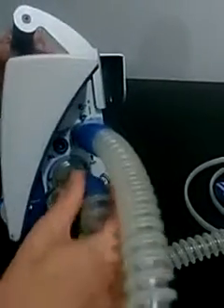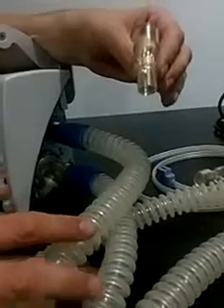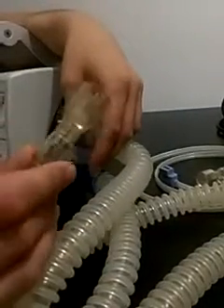How to assemble the accessories with the equipment? You have the patient circuit. You connect one side to inspiration and the other side to expiration. Here is the inspiration and expiration. Then you bring the flow sensor. You should use the flow sensor that's suitable for the patient. For example, we are using right now an adult patient circuit for an adult patient. Then we should use an adult flow sensor.